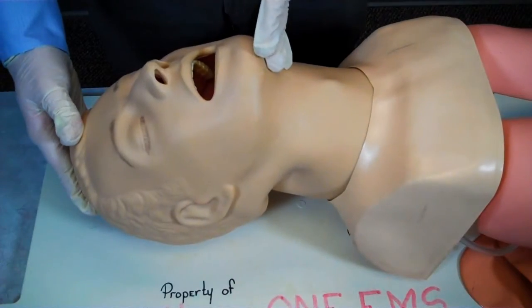Next, I will ensure the patient has an open airway and that no suctioning is required.